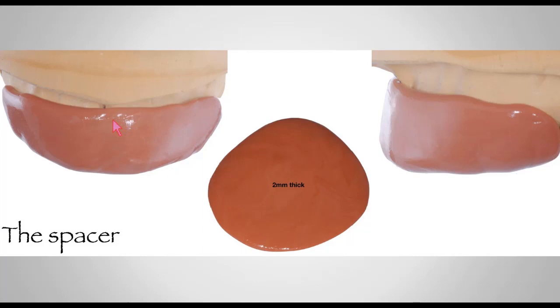And I try to extend this spacer a little bit more distal. So I'm going to extend it at least to the canines or the premolars. You have to involve some teeth that you haven't prepped, and you'll understand later why. So you want to extend it a little bit further back of the area that you're going to be working on. You can see this from the side. It's very thin. It's approximately 2 to 3 millimeters thick, no more than that. And that's what you want. And it's the same all around: facial, incisal, and lingual.